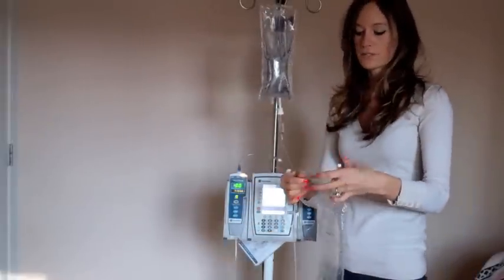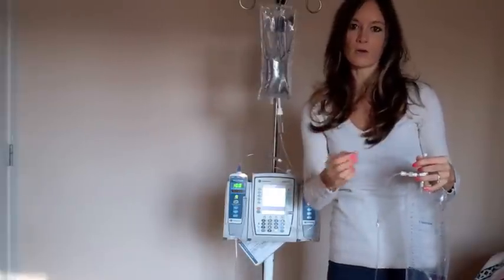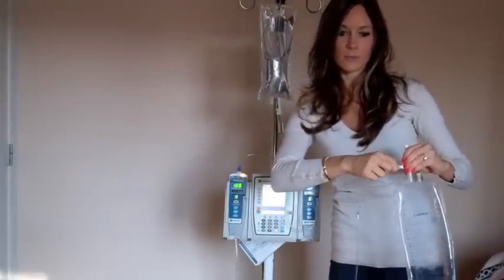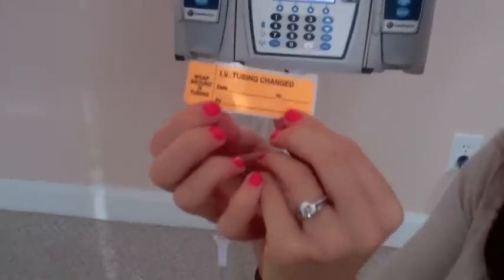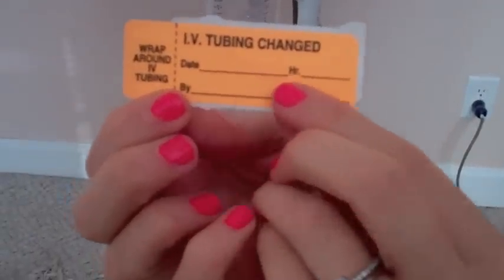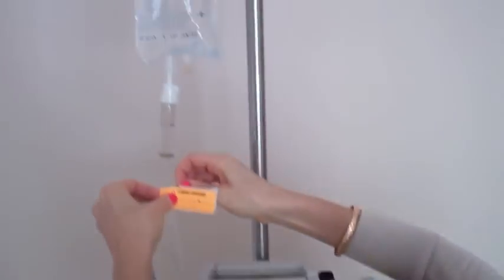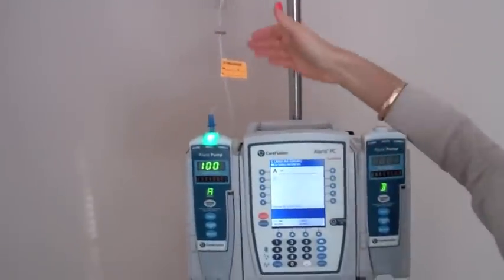Once we have this all set up, we are ready to connect it to the patient. We're just going to pretend this is my patient right here. What we do is take alcohol, clean it very well, and then flush to make sure the IV is working properly. Then we connect the tubing to the patient. Once you have your fluid infusing, you want to date and time it — put the date you started the infusion, the hour, and you can put your initials. Then you stick the label right here on the tubing.